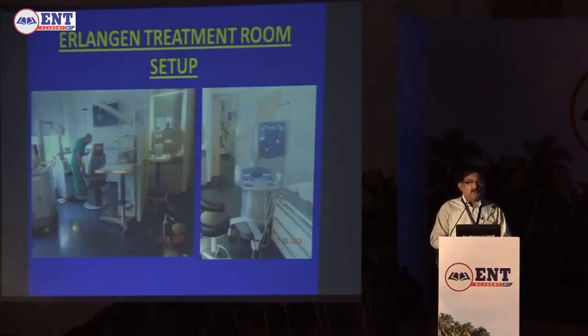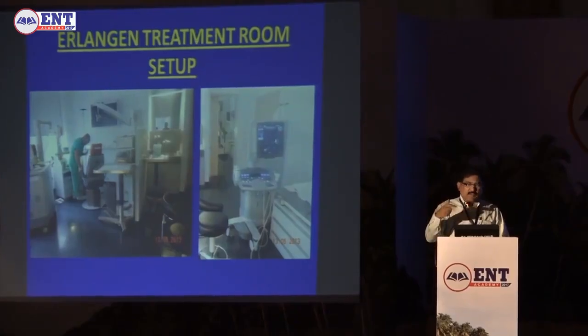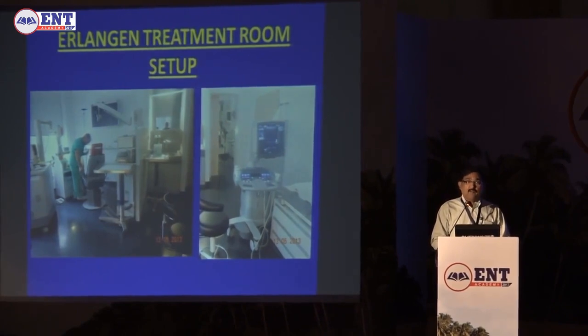You have to learn how to do fragmenting of stones without a lithotripter. Some time back, I think I had used it in social media, how we had linked a hand drill to an otology drill and drilled a stone through and through using a modular salivary endoscope. So some technical innovations you have to do to get out of tricky situations like big stones that refuse to move, because the lithotripter is no longer there. Though it is there in all the literature. All the books you read will talk about the lithotripter, but it is not there.